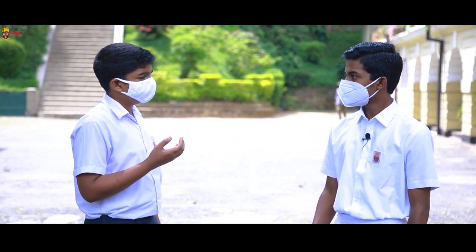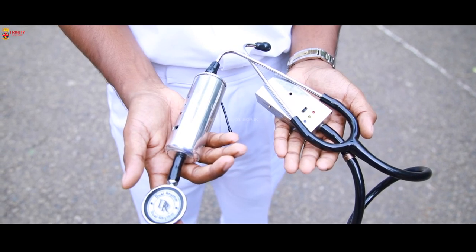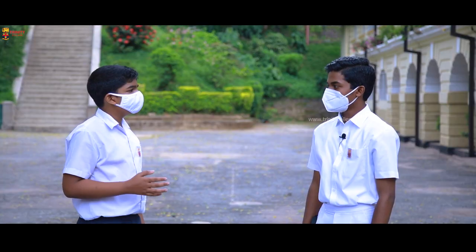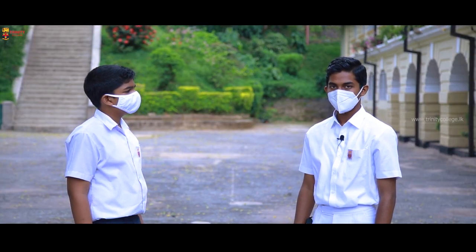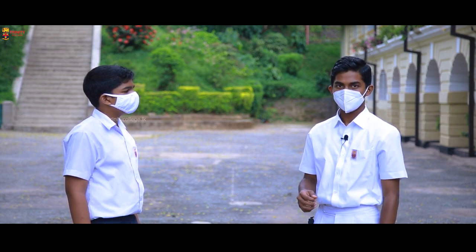And can the doctors connect their own stethoscope with the unit? Yes, they can. It's very simple — they just need to clip the tube of their stethoscope to this device. Were you able to check the accuracy with a normal stethoscope? First I used a normal stethoscope and checked the sounds, and the readings were the same.